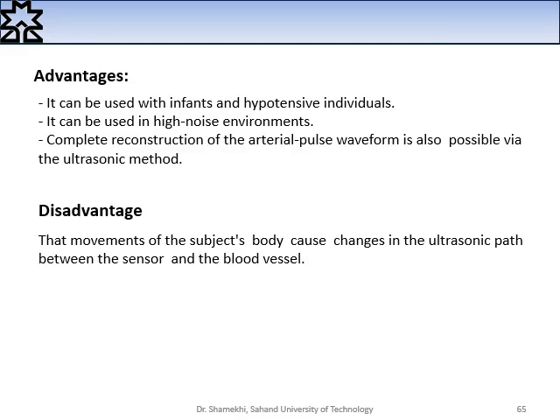The advantages of this method are: it can be used with infants and hypotensive individuals. It can be used in high noise environment. And a complete reconstruction of the arterial pulse waveform is also possible via the ultrasonic method.